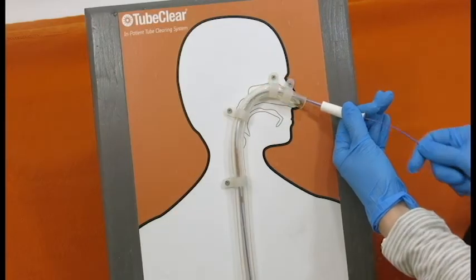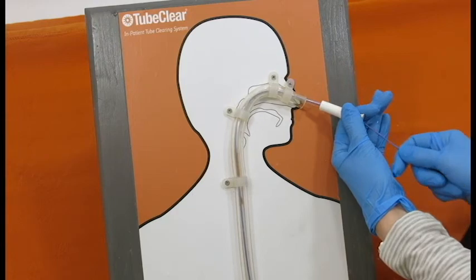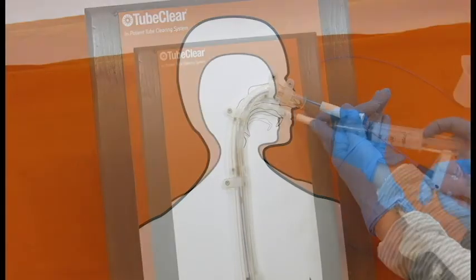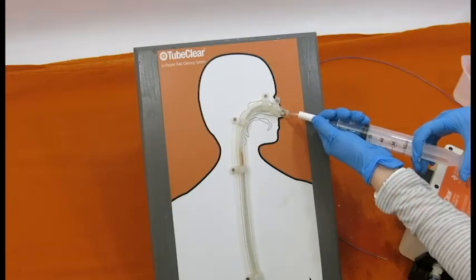Continue this technique with periodic aspiration and irrigation of clogged materials until you can easily flush water through the tube.